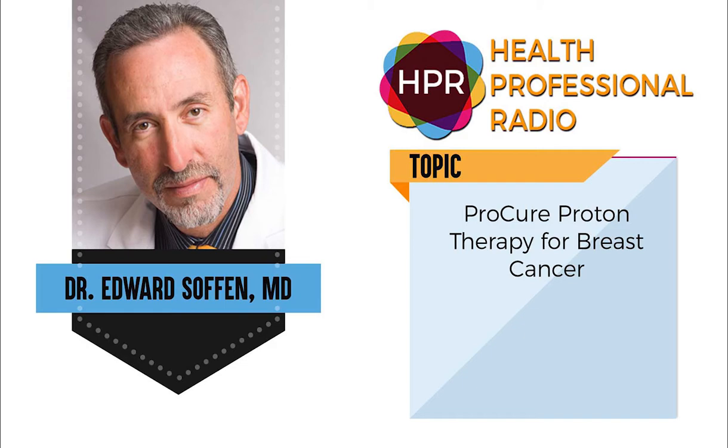Also, in women who have a prosthesis or a tissue expander, the pencil beam scanning, which is a type of proton beam irradiation where we paint little points of protons that can curve and carve around critical structures, we can treat women who have tissue expanders or implants with much less scar tissue and fibrosis because we can literally dance the protons around the expanders without having to treat them.